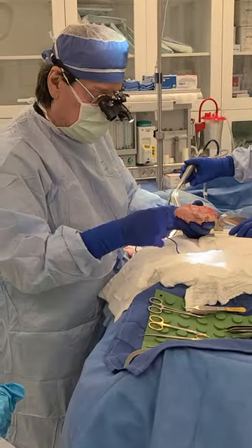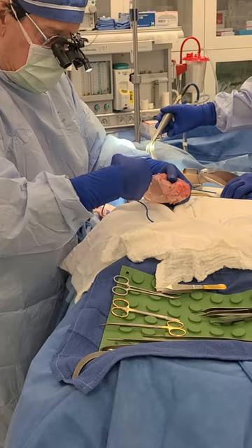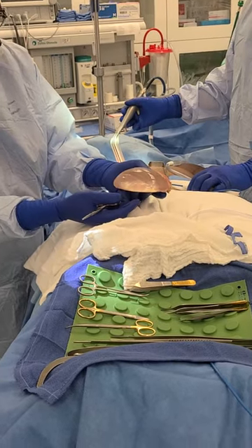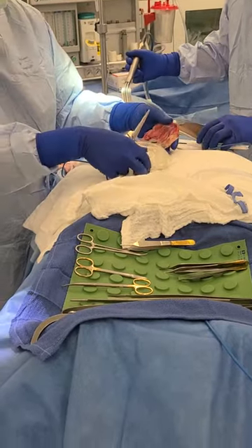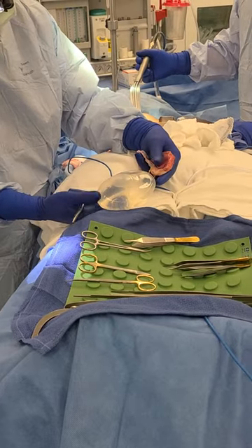So if I open this capsule, what you see is that fold will straighten out, but you see there's still a crease in the implant. And when we take the implant out of the capsule, the implant's perfectly fine.